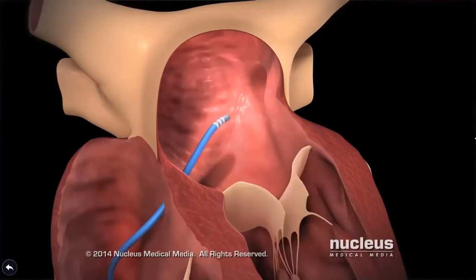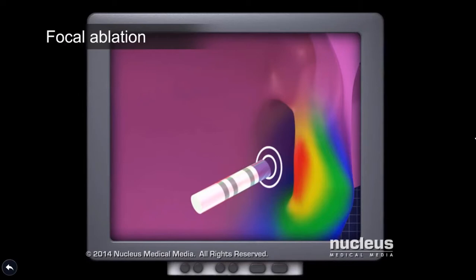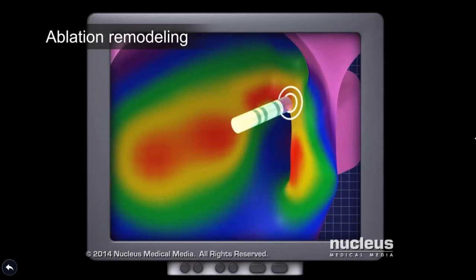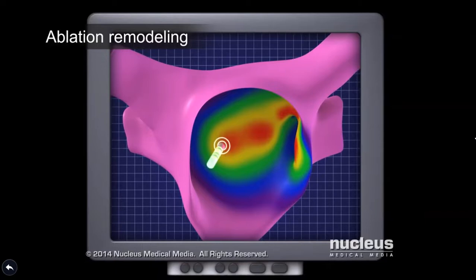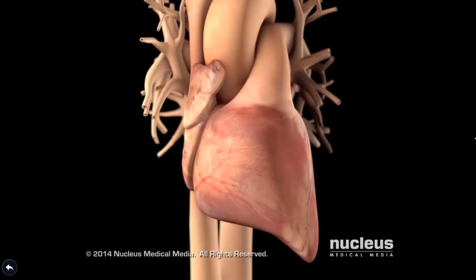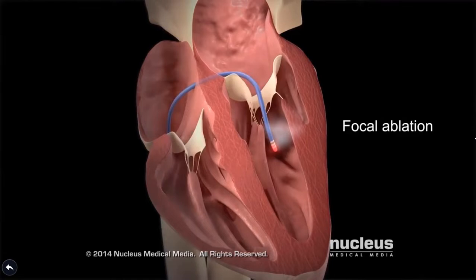For an atrial arrhythmia, a doctor will ablate the atrial tissue causing it. If the affected tissues are small, well-defined areas, the procedure is called focal ablation. If the affected tissues are larger areas with more complex rhythm disturbances, the doctor may perform a procedure called ablation remodeling. Both types restore normal electrical impulses and prevent arrhythmias. The same approaches — focal ablation or ablation remodeling — can also be used to treat complex arrhythmias of the ventricle.